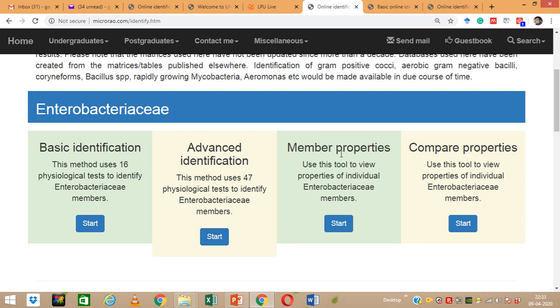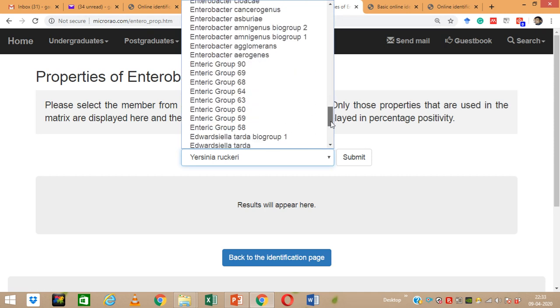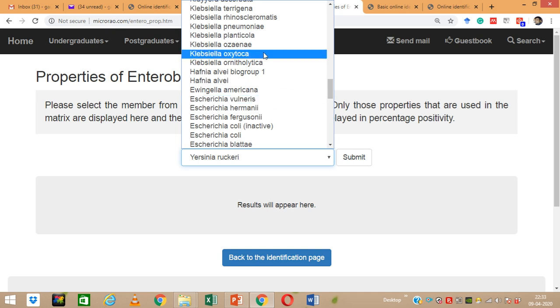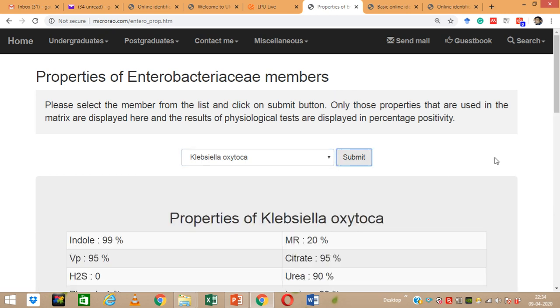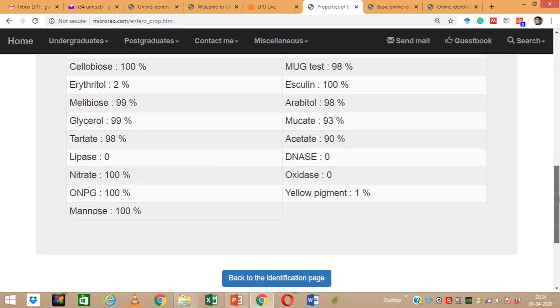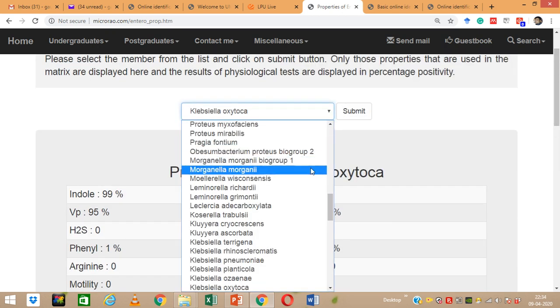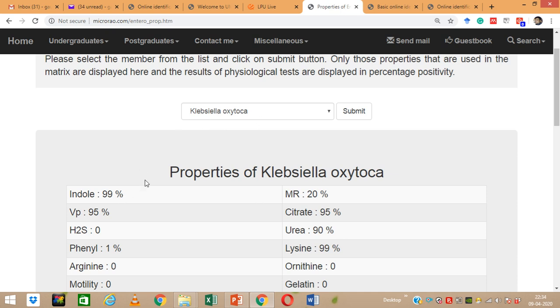For the third option, member properties, a dropdown menu gives you many options of bacteria — all Enterobacteria members. For example, if I want to know the properties of Klebsiella oxytoca, I select it and submit. I can then easily see the probability percentages of different biochemical and microscopic tests for this organism. When it says 99% for indole, it means 99% of strains of this species are indole positive.